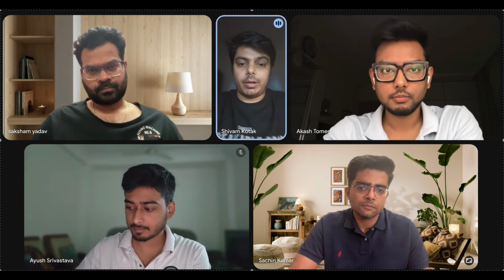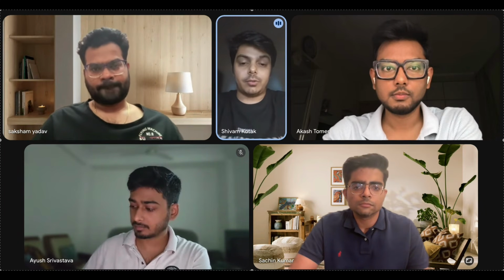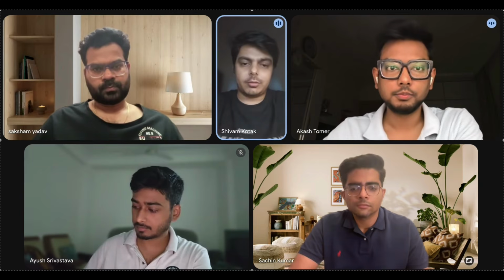So it has reduced your fatigue, you would say? Has it reduced your fatigue and burnout? Yeah, definitely. And it also helps in teaching, because if I give a detailed description of the findings, and I tell Quillr to list the differentials and how to differentiate them on the basis of imaging findings, it can do that as well. So this is how it can be used for learning purposes also.